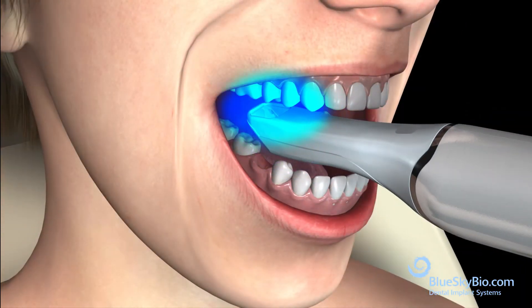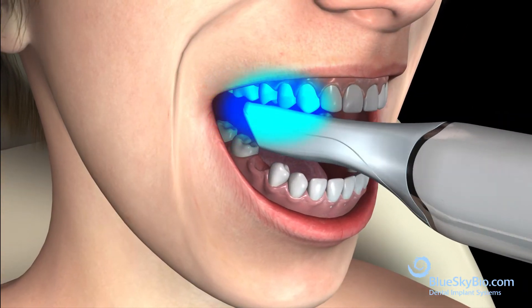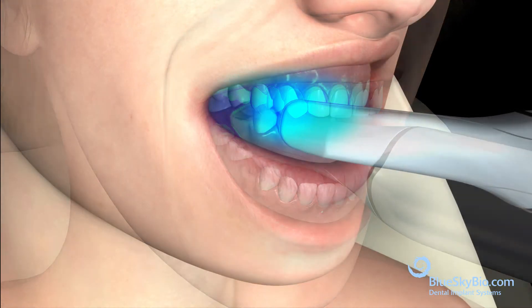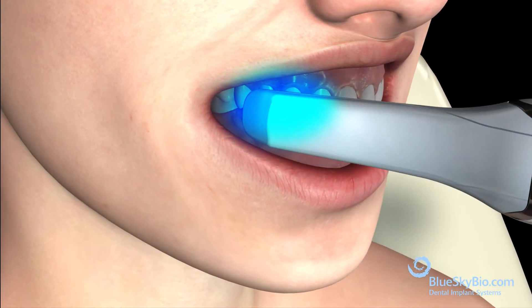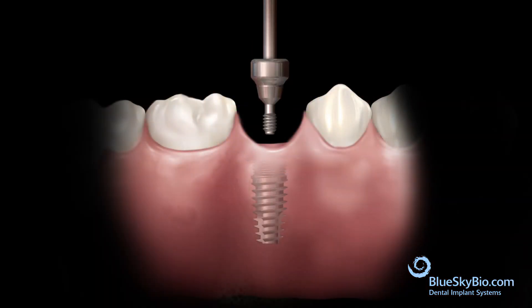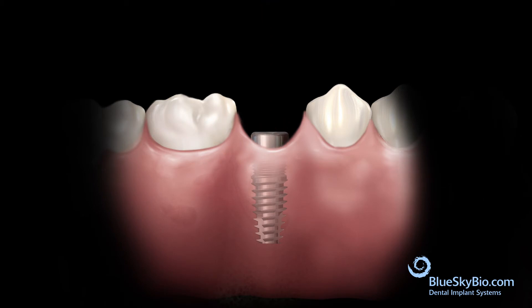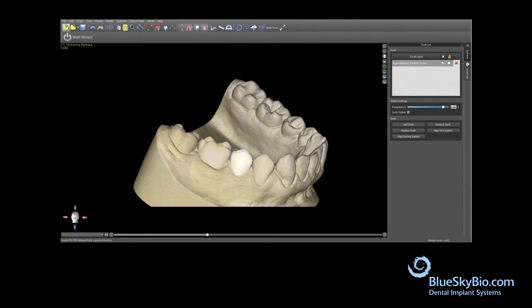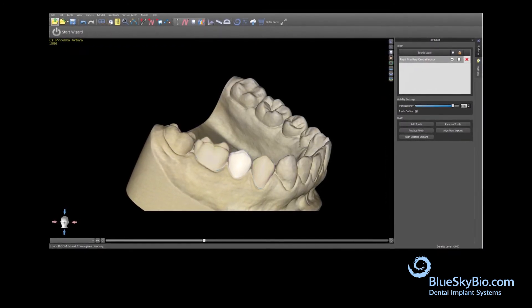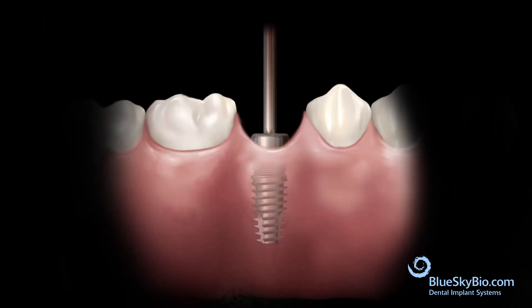Scan the teeth of the opposite arch and scan the buccal surfaces of the teeth in occlusion. Replace the healing abutment. A restoration is designed in a CAD/CAM program and a self-supporting ceramic crown is manufactured.